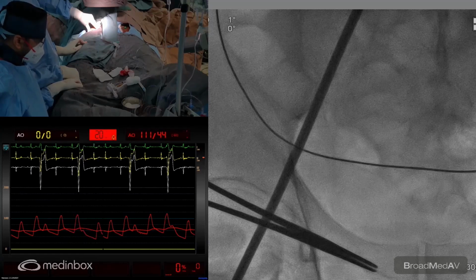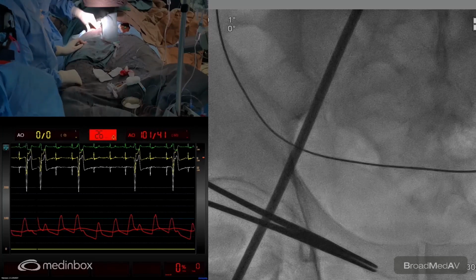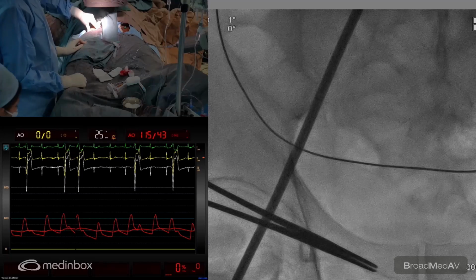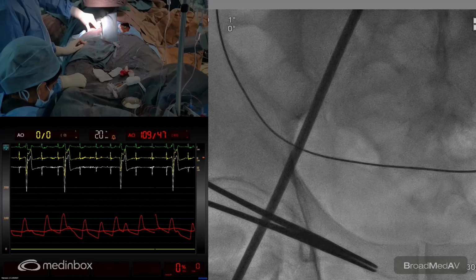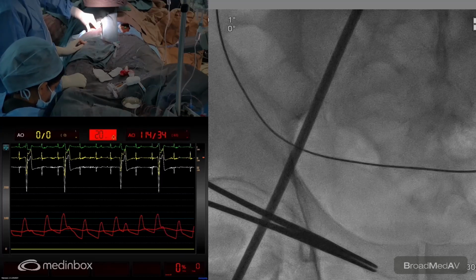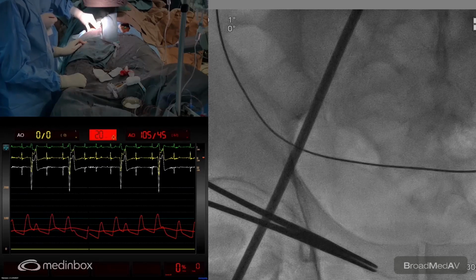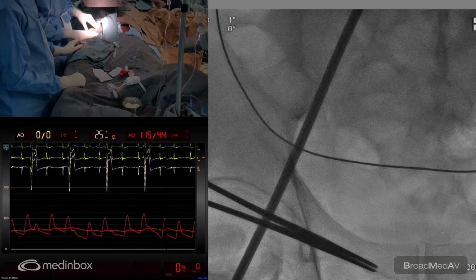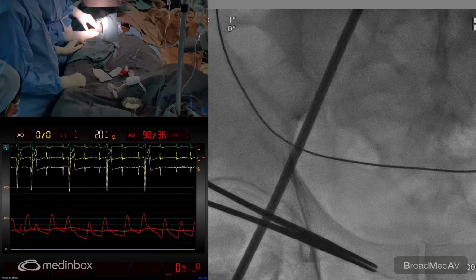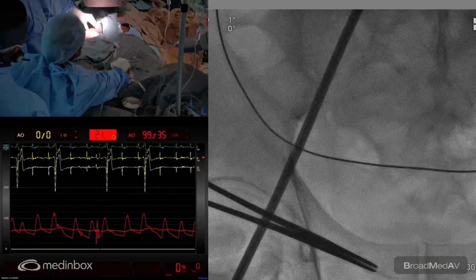One is, is there any coronary ostial closure? The left coronary height seems to be okay, and the sinus of Valsalva looks large. I don't think this is likely to happen, but an aortogram simultaneously during a balloon dilatation with an 18 millimeter balloon would help us to check that. So these are the two reasons why we would put a pigtail catheter. You could use a radial access if you wish to, but we have taken femoral in case we have a problem in the coronary during balloon dilatation.